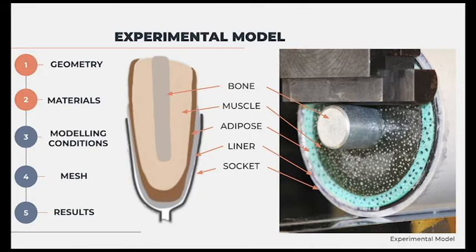Although this is significantly stiffer than bone, as bone has a much greater Young's modulus than the soft tissues, it acts as a rigid body in the system. The other components were modelled using gelatin, foam, rubber and PVC as previously completed in the literature. The experimental model was loaded at 2 points on either end of the steel rod, whilst being both vertically and horizontally supported on the base.